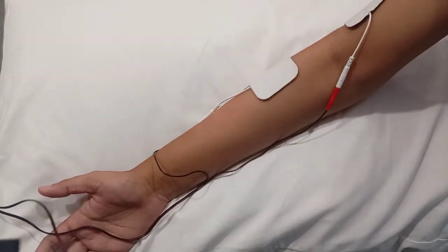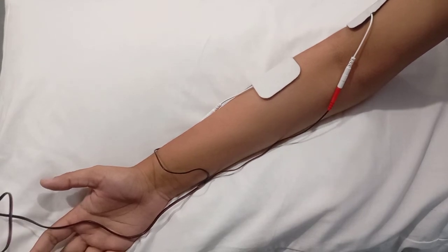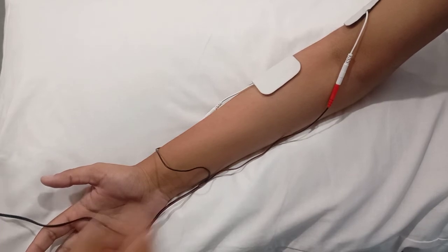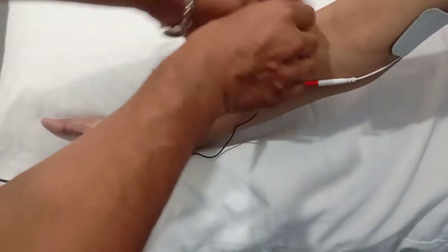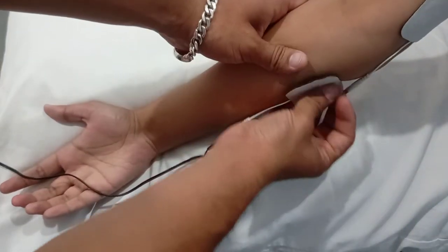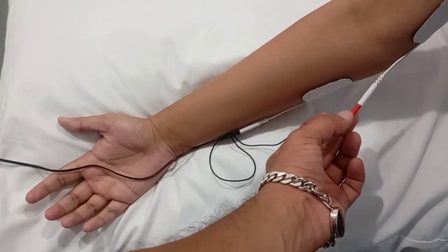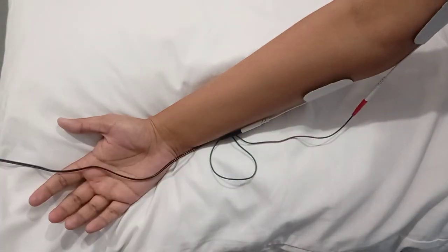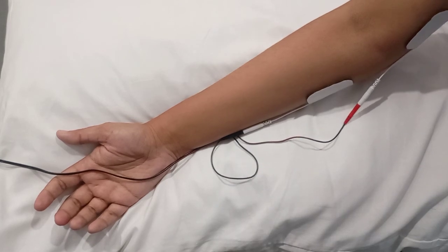That's how you apply TENS in lateral epicondylitis. The same parameters can also be used for medial epicondylitis — you just need to place the electrodes on the medial side. One more thing to remember: it makes no difference whether you keep the red or black electrode up when using TENS, but if you are using EMS, it can make some difference. Thank you very much.